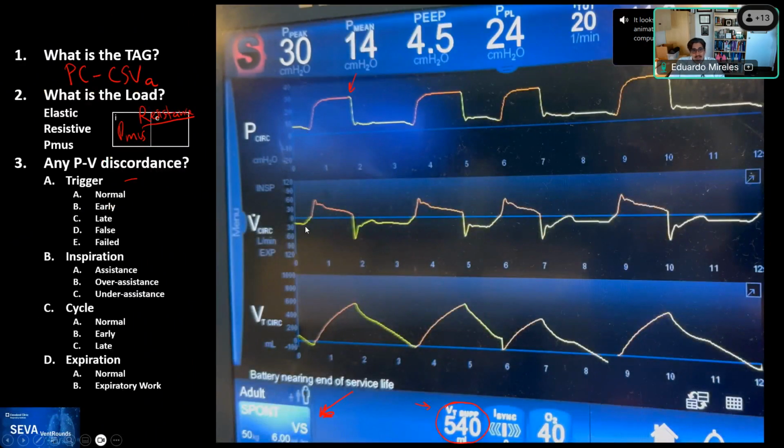And she had a 7.0 tube and she was a big lady. So we decided let's take a bronch and see. And we found the posterior end of the tube buried in the trachea, with phlegm stuck, so the outlet of the ET tube was partially open. And that's why I think the flow, especially in the expiratory phase, was stuck.